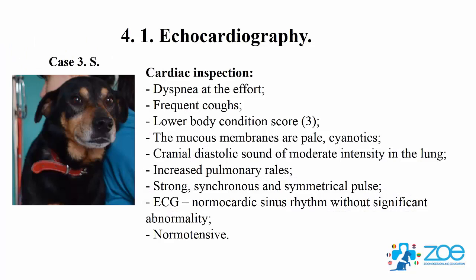Echocardiography, Case 3. Cardiac inspection. Dyspnea at effort, frequent coughs, lower body condition score. The mucous membranes are pale, cyanotic.